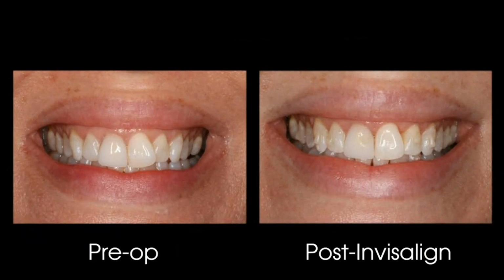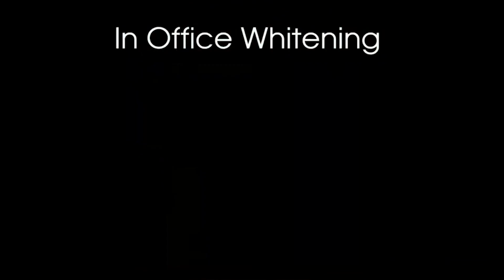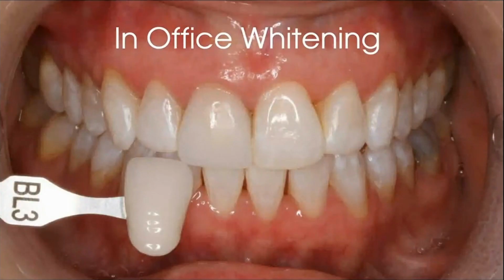So pre-op, she looked like this. Post Invisalign, what do I have? I have straight teeth, but 2 ugly centrals. So we're going to do something about that. She did some in-office whitening, and from there we bleached them a little bit whiter. So she got a color change.